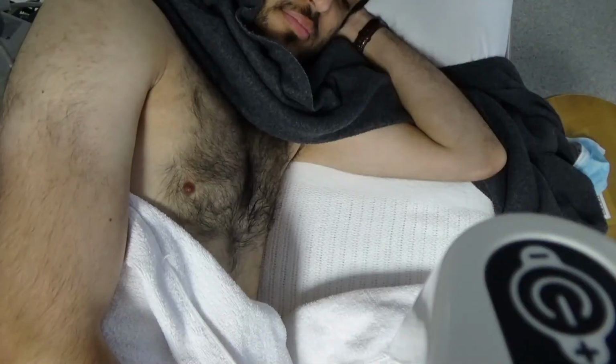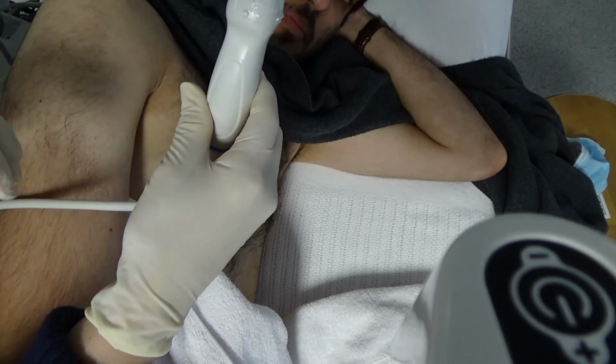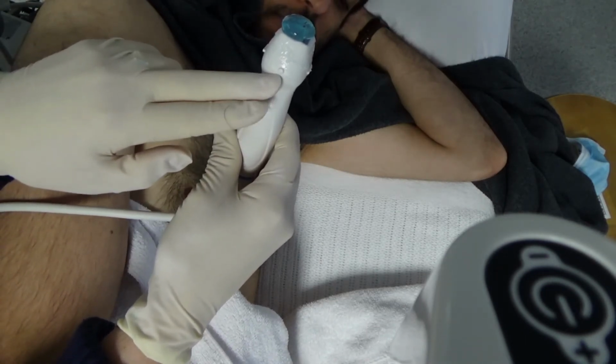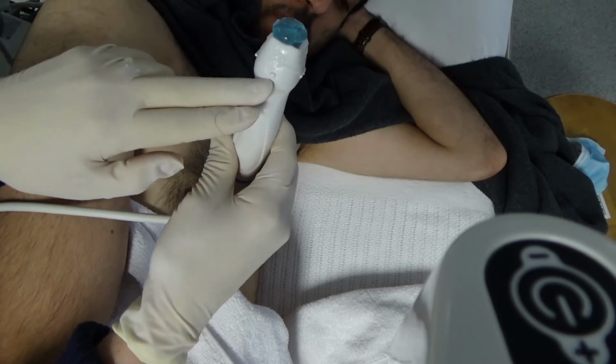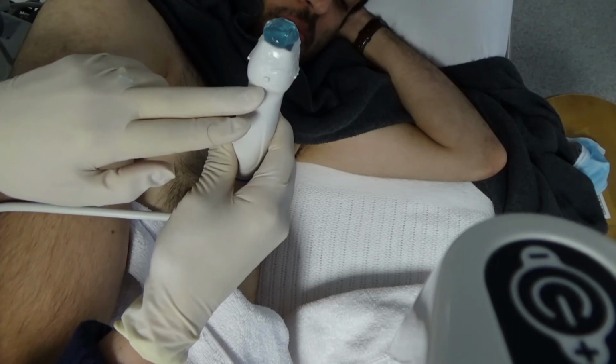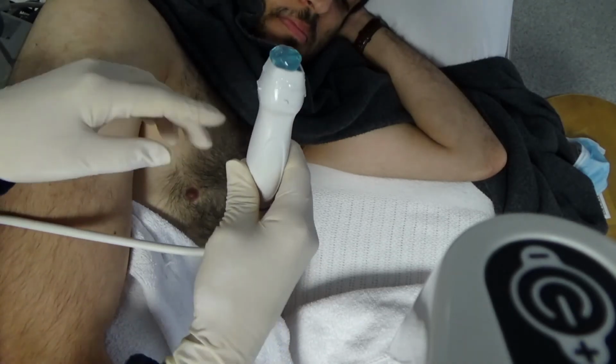All right, now I've got a lot of gel on this probe, but I'm just going to show you. We've got the probe marker here. The probe marker on an apical four-chamber is going to point towards his left arm or left shoulder, or some will say the left axilla. The point is it's got to be pointing towards his left shoulder.